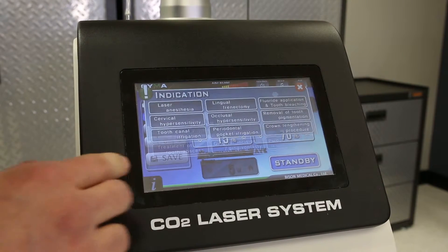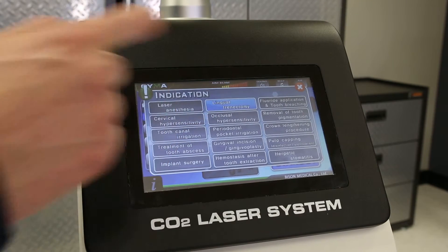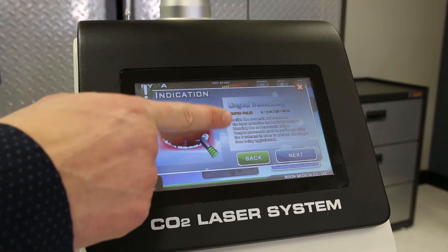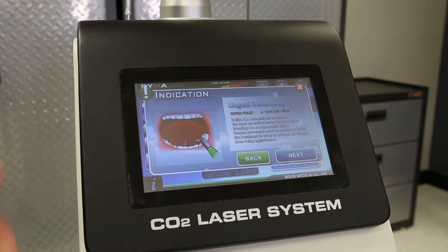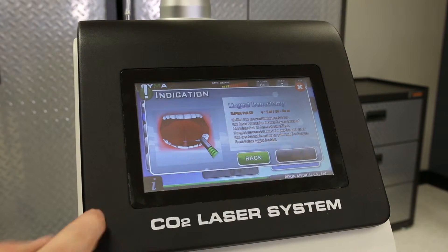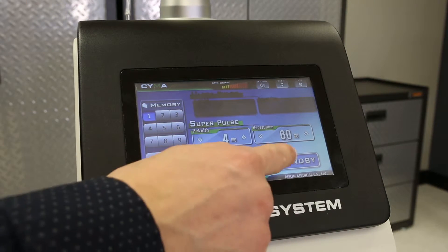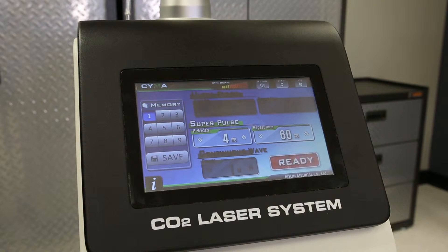If you hit this icon, it will show you 14 preset indications. You choose one of these — for example, lingual frenectomy — you can read about it. It shows a pulse width that it will start on. If you hit next, it will preset it for you, and then you can hit standby and you're ready to go.